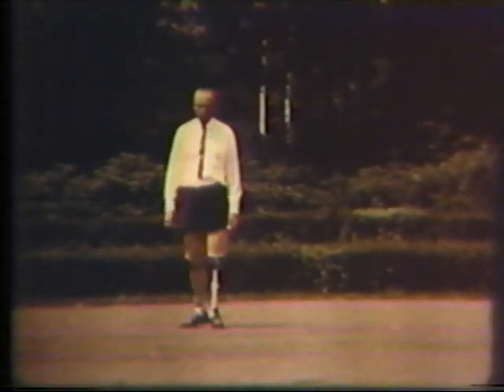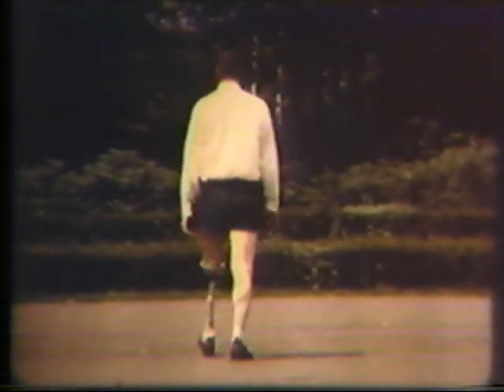From the prosthetic standpoint, this can be caused by a prosthesis which is too short. Also, a lateral wall which is improperly shaped can fail to provide adequate support to stabilize the femur; hence the gluteus medius cannot do its job of maintaining a level pelvis. Finally, if the medial wall is too high, pressure on the pubic ramus will result, causing the amputee to lean away to minimize discomfort.